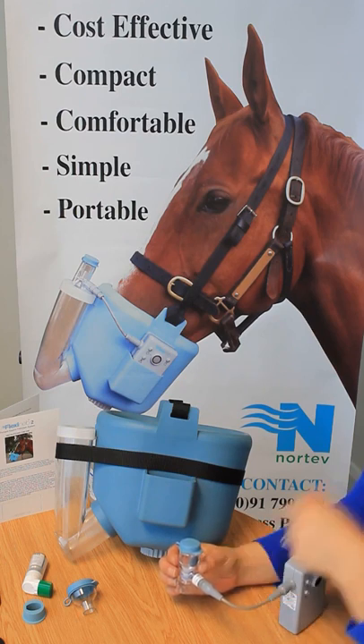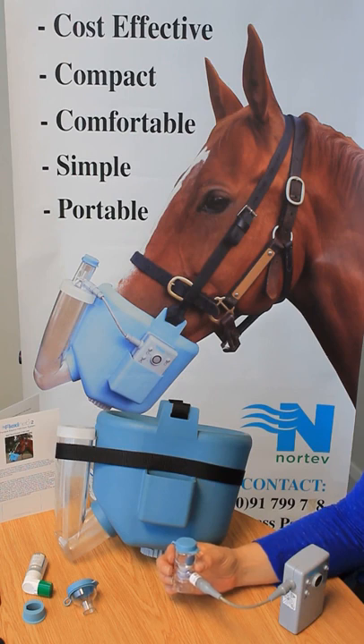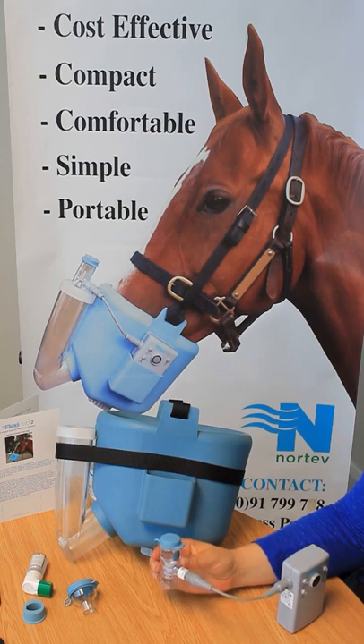Grey cups are the standard cup and deliver 99% of antibiotics, bronchodilators, steroids, mucolytics, and other therapies.